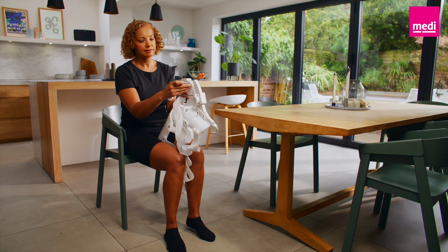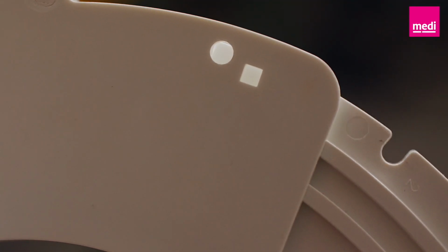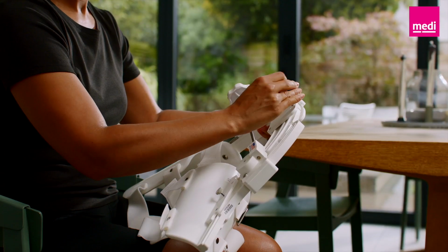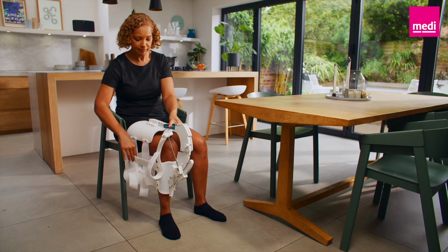Take out the pull pin. Slide the shin assembly out until it reaches the next notch. Reinsert the pull pin to secure and place the brace back on your leg to continue your therapy session.